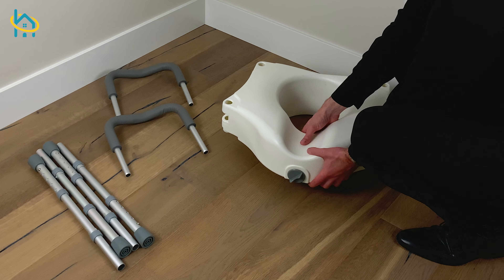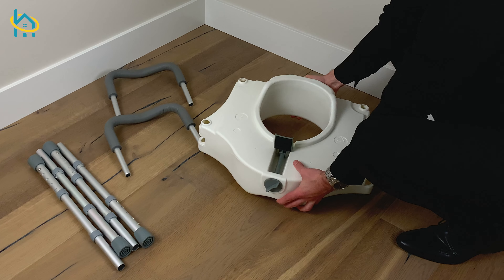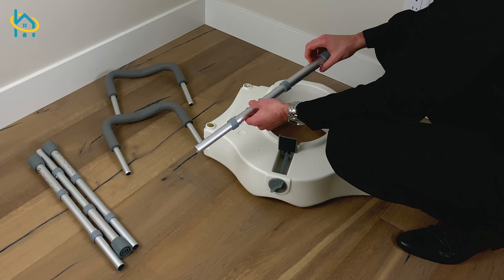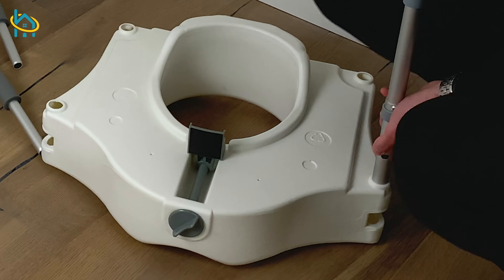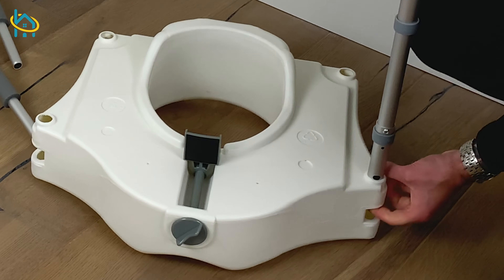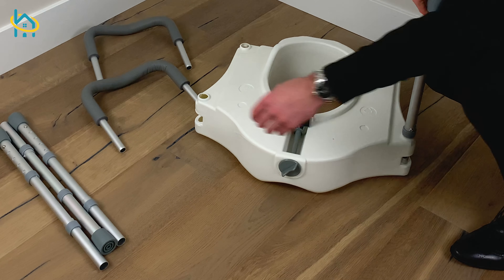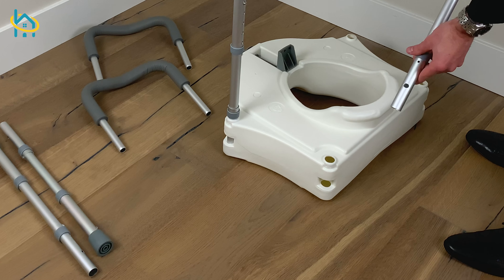First, lay out and inspect all of the pieces. Next, flip over the seat so the bottom is facing up. Now you're ready to install the legs. Press the open end of the leg into the holes on each side of the toilet seat. Make sure the leg is pressed all the way in until the grey stopper is against the seat. Repeat this step for the other three legs.